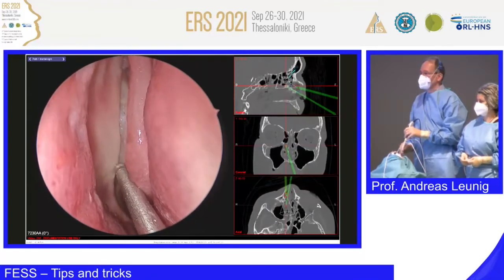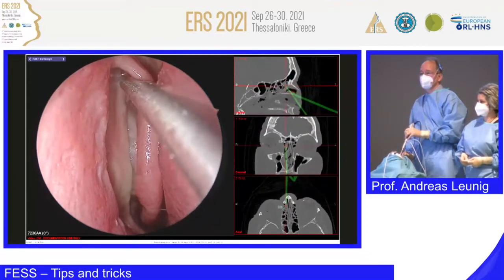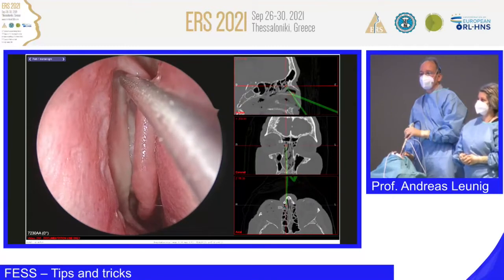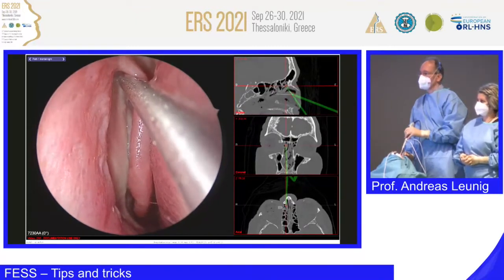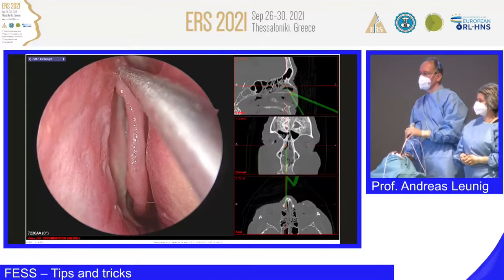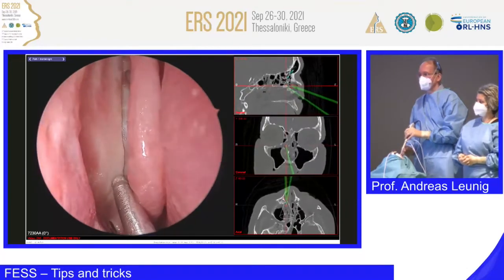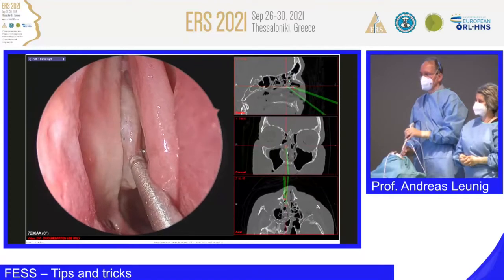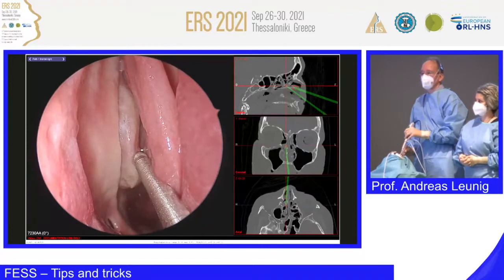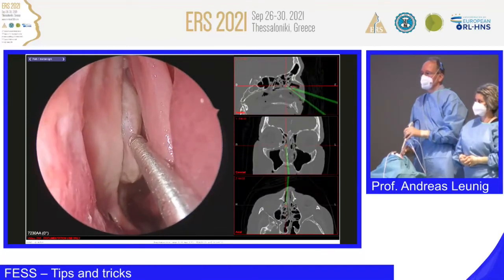forward, by entering the frontal sinus. So we are going up here. Now let's have a look. The attachment of the uncinate process, it's up there. So you see, we are not very high up, but we are reaching step by step here the frontal recess, the pre-chamber of the frontal sinus. And you should be sure where you are and if the system is really working. So you still are responsible for what the system is doing, and if this is the case, it helps you a lot. So this is the ethmoidal bulla, and you see now, I think the picture at the right top shows very nicely the ethmoidal bulla, and we are just on the anterior wall of this cell.